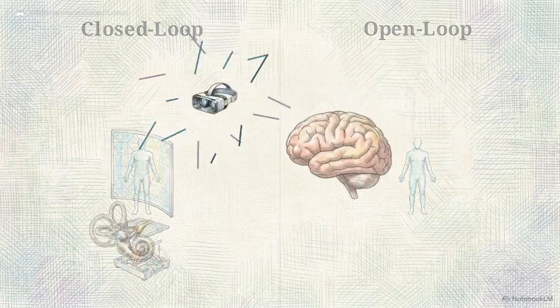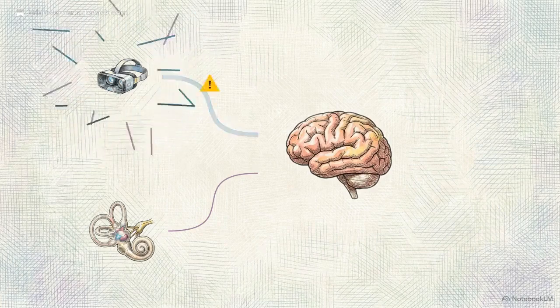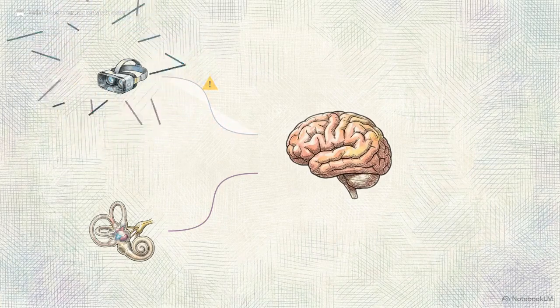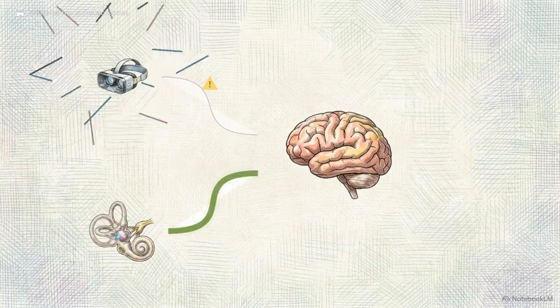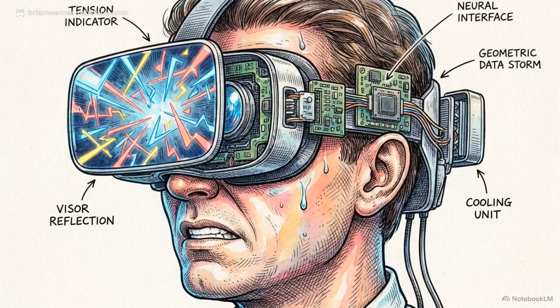Because the VR environment moves randomly, the brain cannot predict or sync it to body movement. This forces sensory reweighting. The brain must recognize that the visual data is unreliable and shift to vestibular data to maintain posture. Open-loop optokinetic flow creates a sensory conflict far more intense than a closed-loop system, forcing the brain to adapt immediately or fail the test.